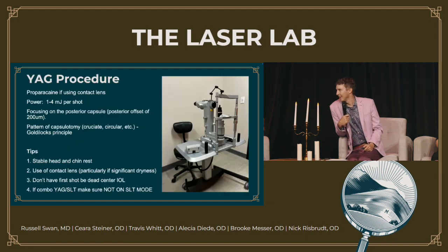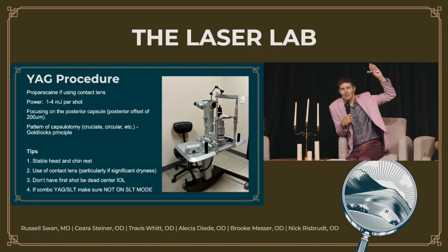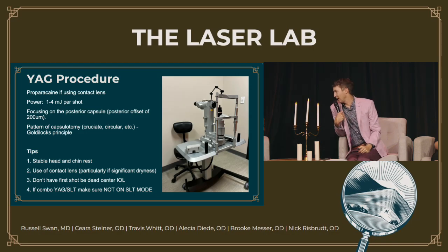With regards to the procedure itself, I'm curious, show of hands, how many people have actually watched or seen a YAG ever be performed? Raise your hand super high so I can see. Okay, a decent number of people have. Again, as described by Sarah, I do tell patients, this is the easiest, simplest procedure that we do in eye care. It's going to take about 10 to 15 seconds to do. There's no pain. There's typically no drops afterwards. There's no restrictions in their activities.